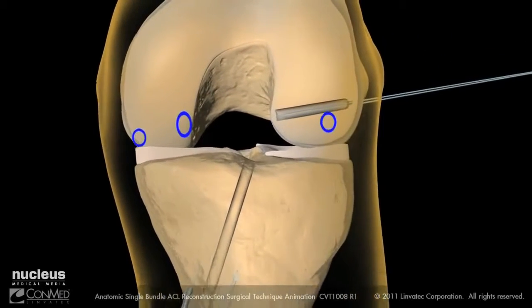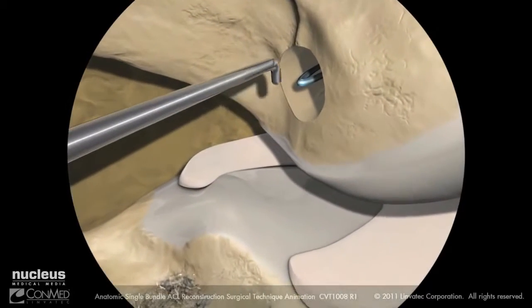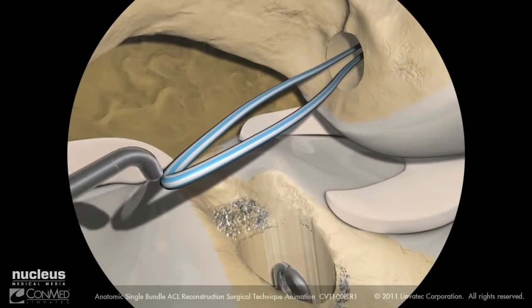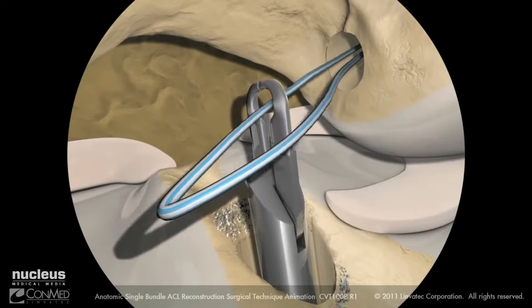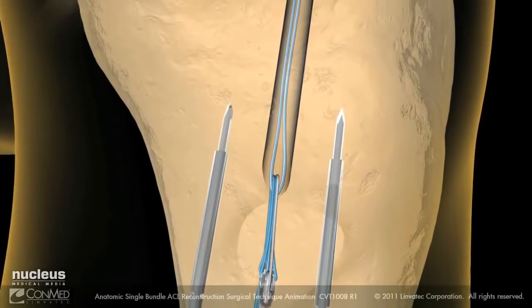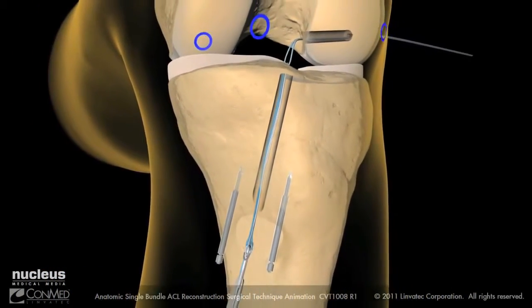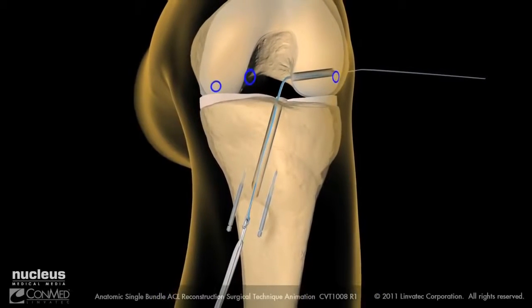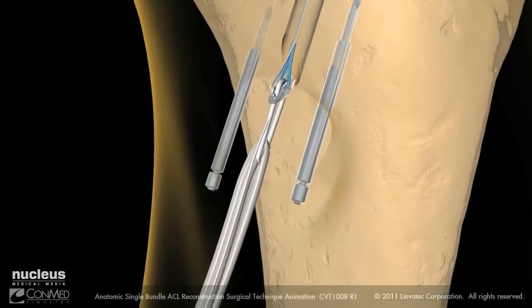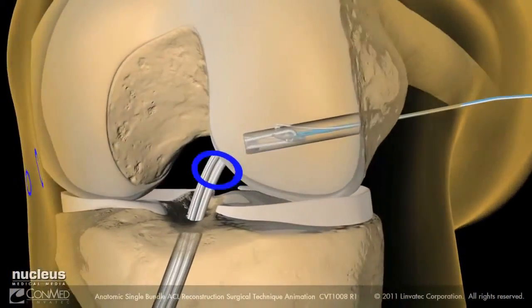Place a probe into the accessory anteromedial portal to bring the loop of the suture into the joint. Retrieve the loop through the tibial tunnel using suture retrieval forceps. With the suture loop exposed externally, load the suture strands of the exo-button loaded graft into the passing suture loop and pull them through the femoral tunnel, making sure to keep the graft construct outside of the tibia. Pull the exo-button loaded graft into the joint and through the femur while hyperflexing and elevating the knee to ease the graft passage.